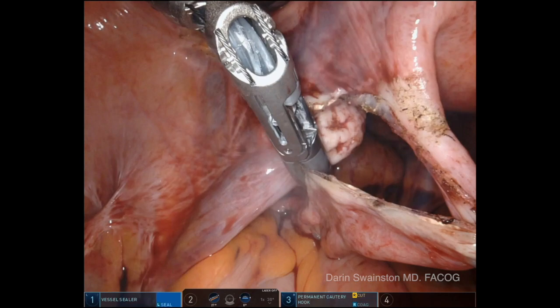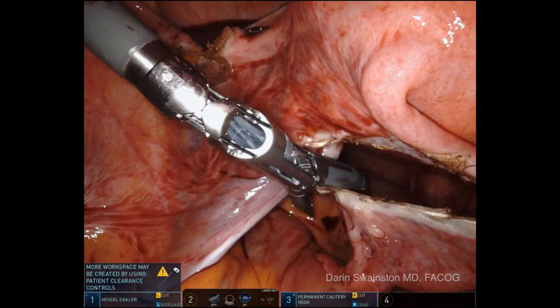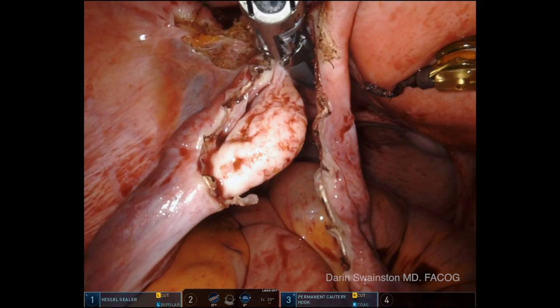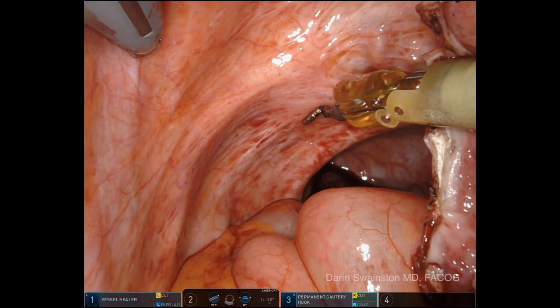Same kind of idea: I use the hook to pull on the mesosalpinx in the middle of the fallopian tube to create counter traction, and then I use the vessel sealer to take the entire tube off. The hook is always used to push up on the uterus and to give traction and counter traction. The person lifting up on the uterus plays an important role here. I'm making sure that the ovary is lifted way off the pelvis so we can see that the ureter is very deep and out of the way.